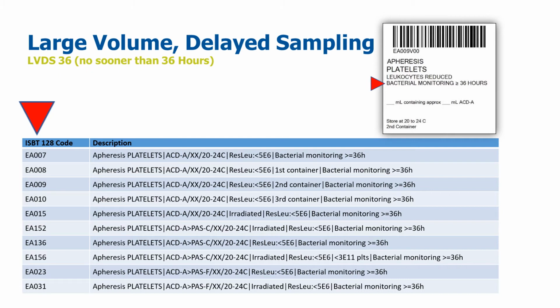You may notice that these ISBT 128 product codes have the new EA prefix. Your donor or transfusion service computer systems may require a software patch or upgrade in order to use or receive these EA codes. If you are modifying or dividing and printing labels, your label printing software may also need to be upgraded. Be aware that ICCBBA is rapidly creating new product codes. About 600 EA codes have been defined since September 2020.